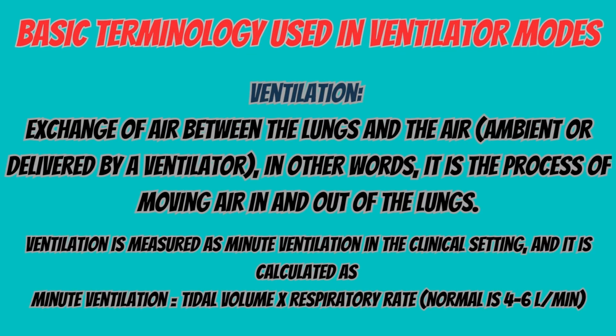Ventilation: exchange of air between the lungs and the air, ambient or delivered by a ventilator. In other words, it is the process of moving air in and out of the lungs. Ventilation is measured as minute ventilation in the clinical setting, and it is calculated as minute ventilation is equal to tidal volume multiplied by respiratory rate. Normal is 4 to 6 liters per minute.